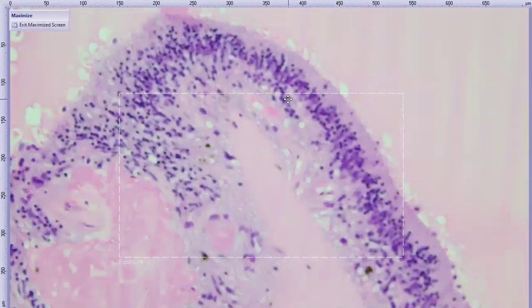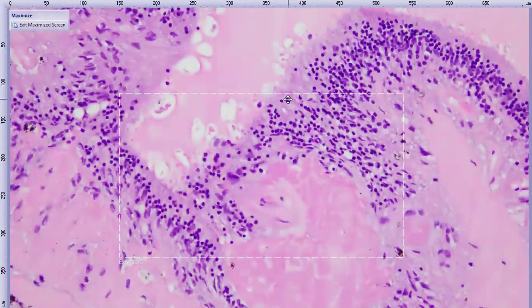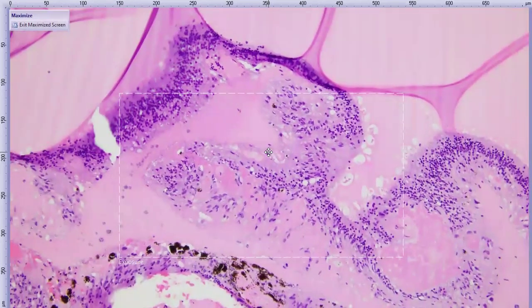So this is starting to look like something vascular, hematologic, a bleeding proteinaceous problem, right? Here's another vessel right there. So not a lot of inflammation anywhere in this eye. The main thing is this humongous exudation, tissue necrosis, and retinal hemorrhage causing retinal detachment.